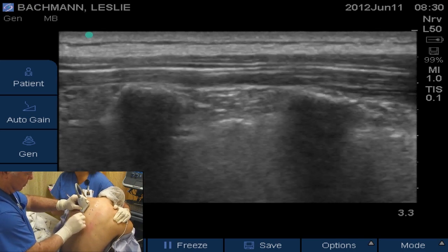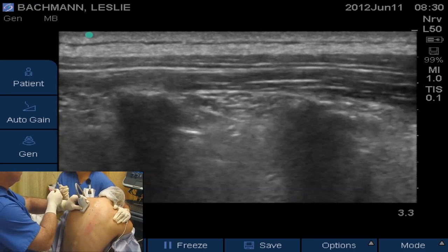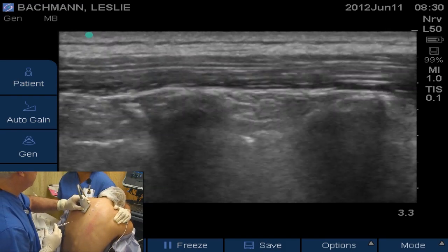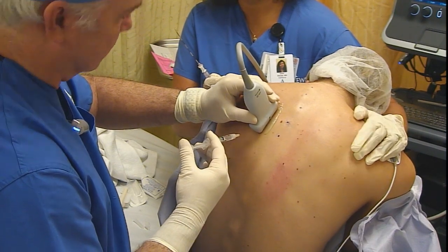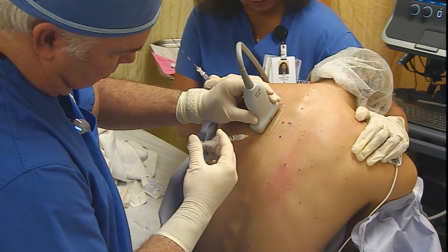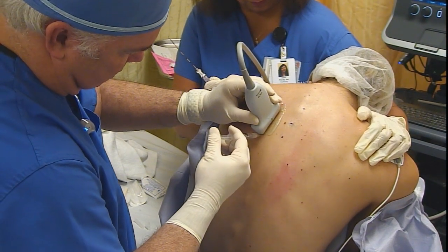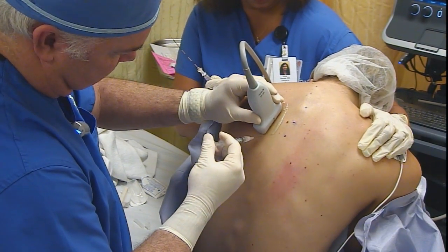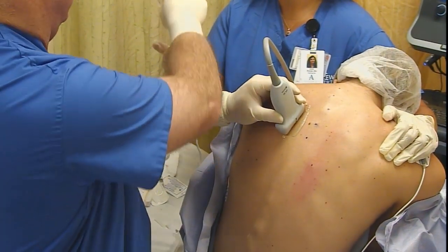We have to get the tip of our needle in between the costal transverse ligament and the pleura to deposit our local anesthetic to make this a successful block. One of the important factors is the injection port where you start your injection has to be very close to the probe to be able to get the tip of the needle between the two transverse processes.